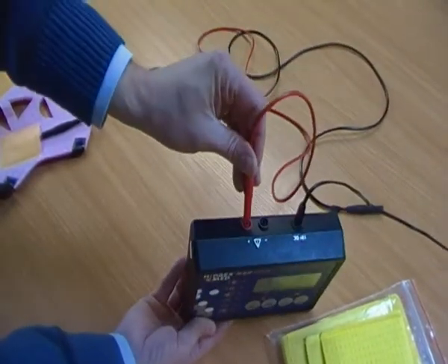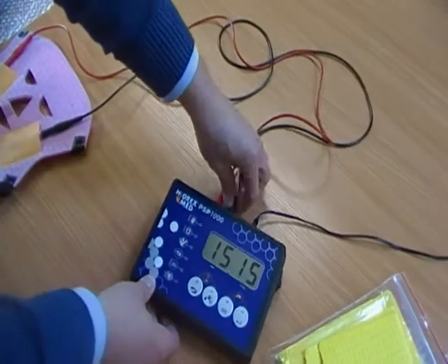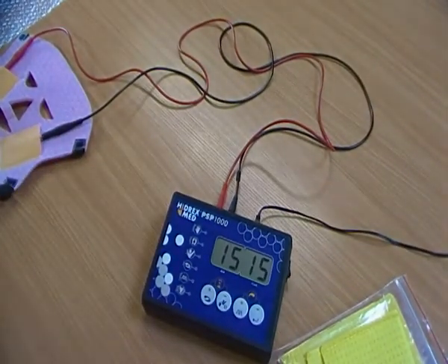They're all colour coded — just colour coded ports in the back of the control panel. That's basically how you would set your electrodes up.